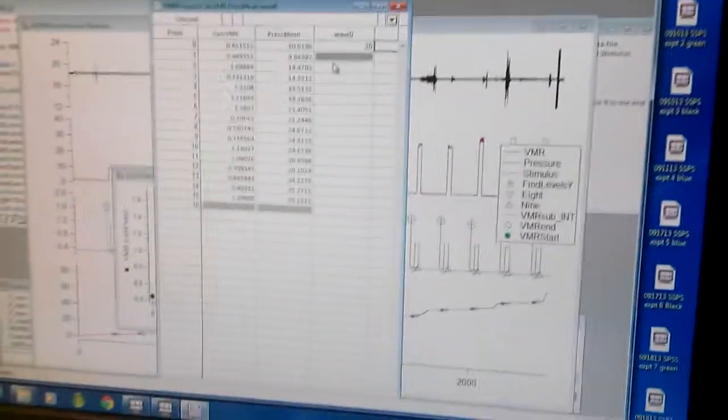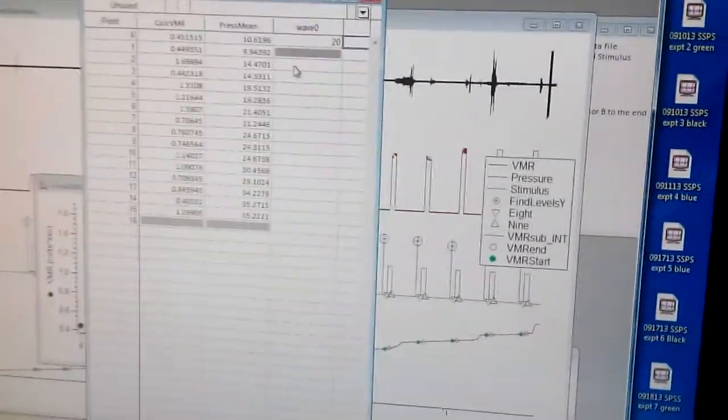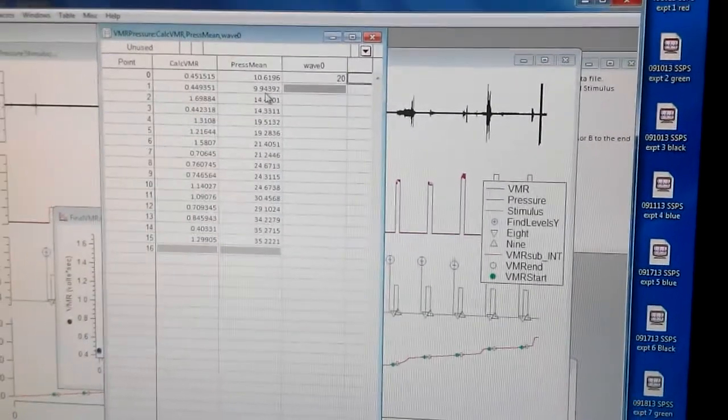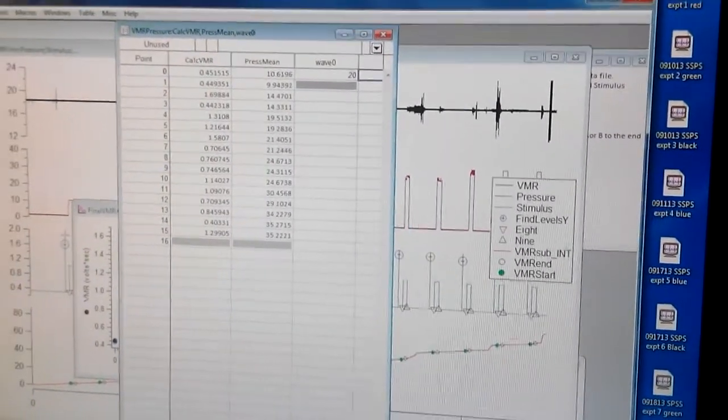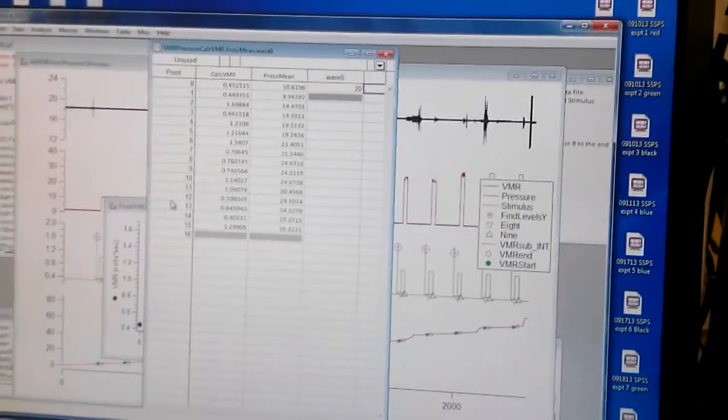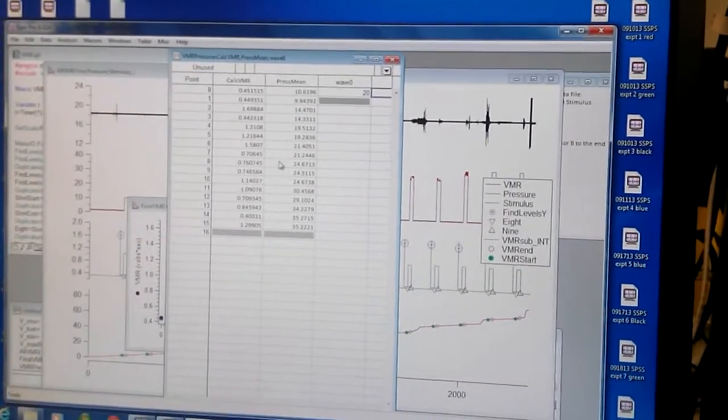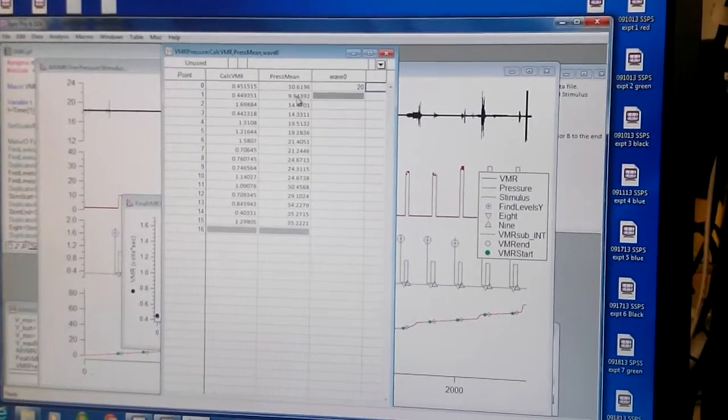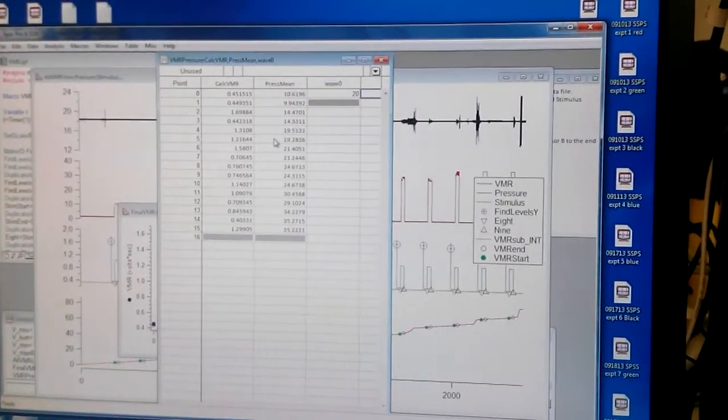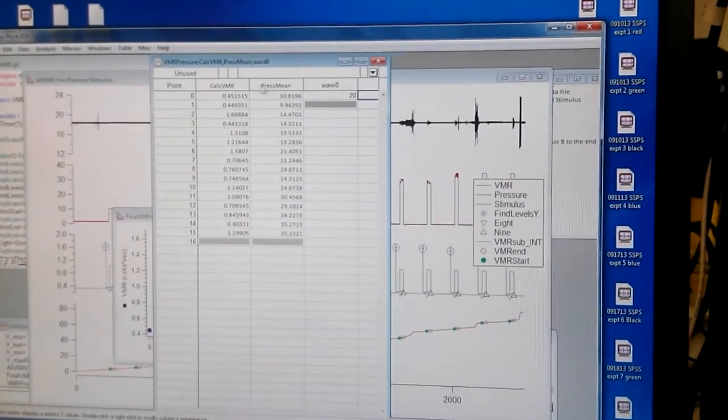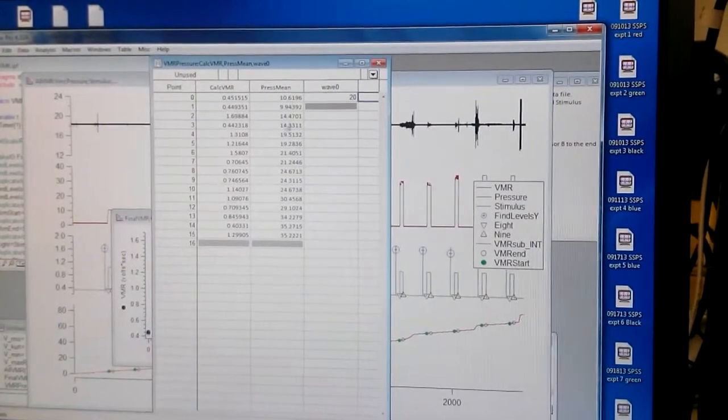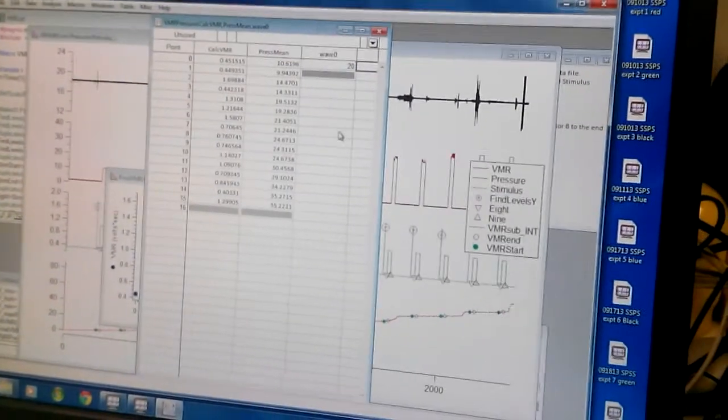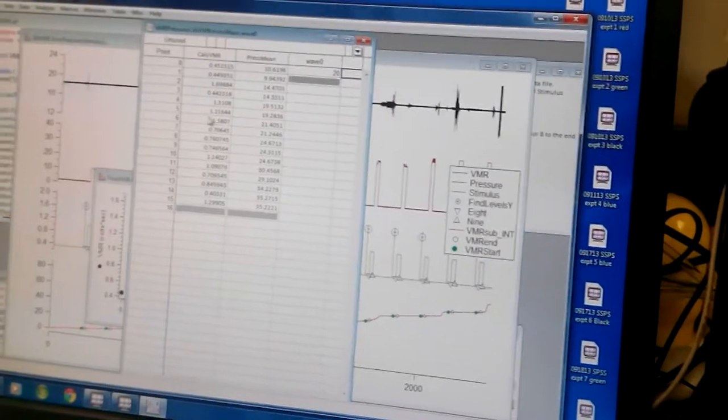Do I need to do that? I mean on this file. Well, you don't have to do it in this file as long as you remember what pressure represents what. Either you can double check with your notebook, or when you are saving the file initially, you can calibrate right that itself. That way the new calibrated value would be here then. But as long as you remember what pressure, because this press mean or pressure mean is actually going to be very lower than your actual pressure. OK. Yeah.